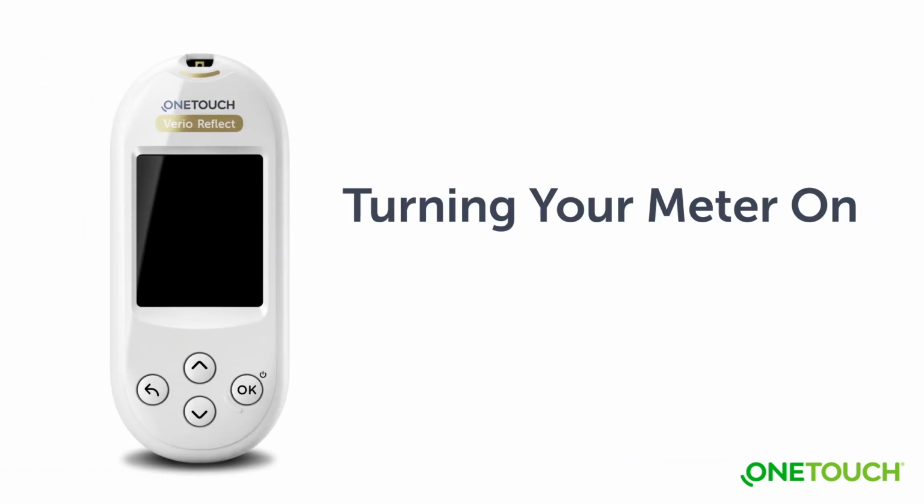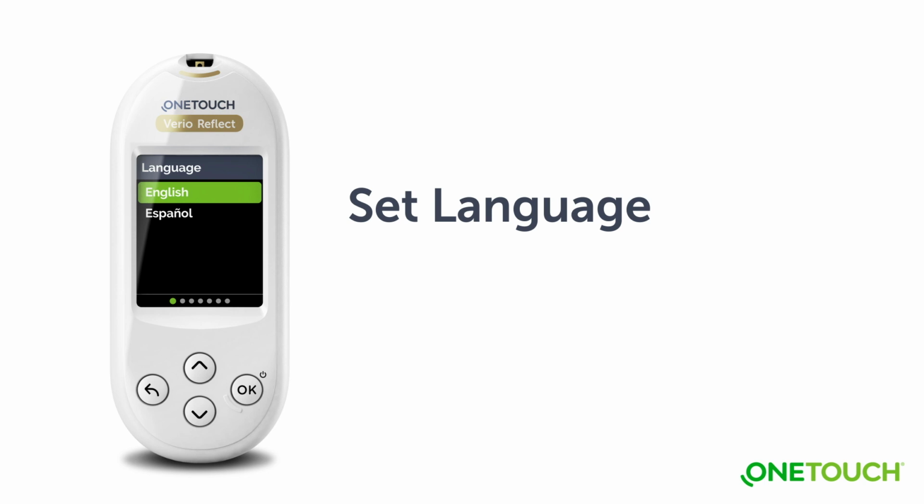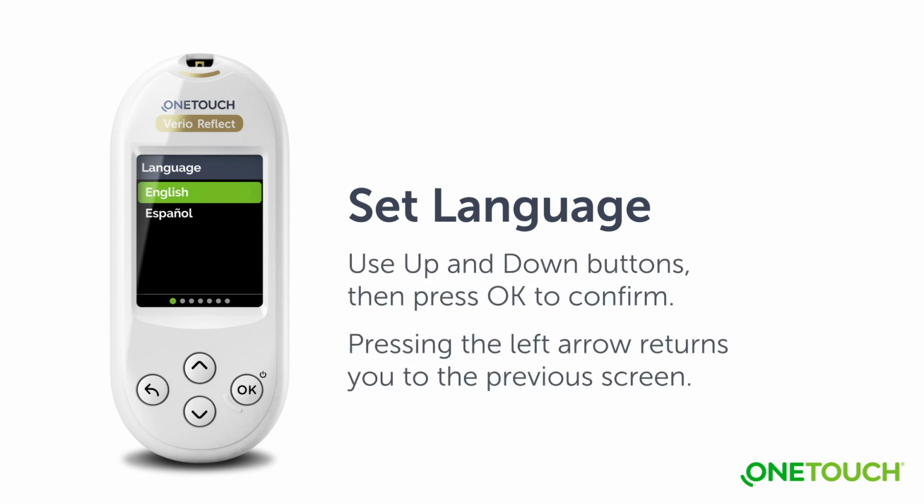To turn your meter on, press and hold the OK button until the welcome screen appears. Once the welcome screen is displayed, release the OK button. You can also turn the meter on by inserting a test strip. Before using your meter for the first time, you will be prompted to set the language, time, date, range limits, daily test goal, and 90-day average target. The meter comes preset to help you with first-time setup.